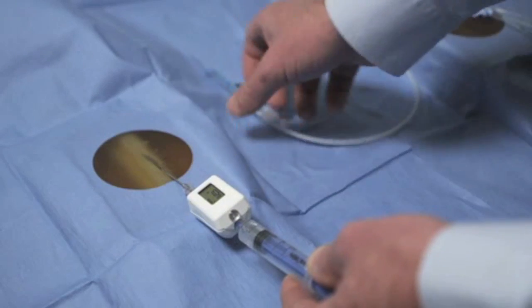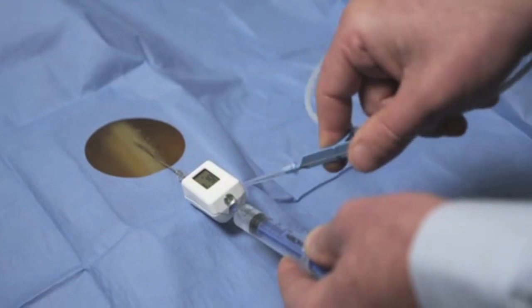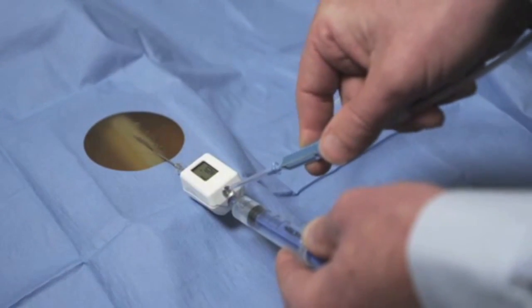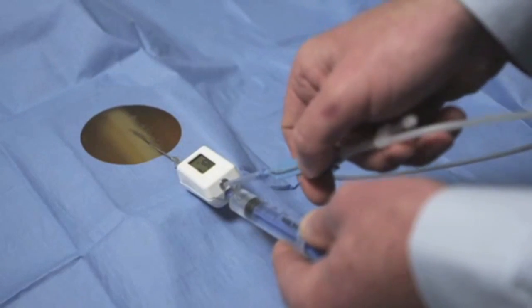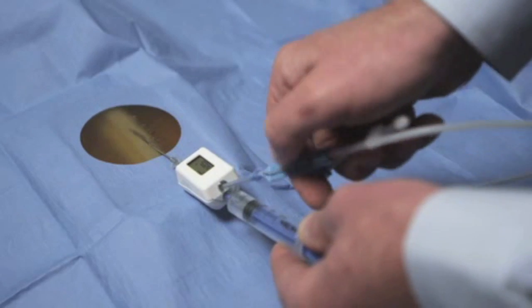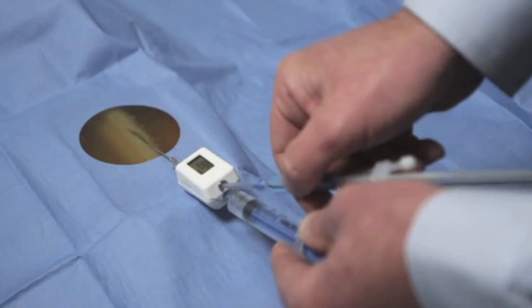Once it's confirmed that the needle tip is indeed venous, the Compass has a sealed guide wire port on the rear here, where without needing to detach anything, a guide wire can be advanced through the port into the vein, allowing venous confirmation of guide wire placement.